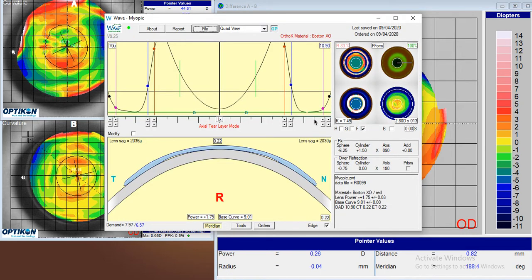Back to the lens, how that translates to the lens view, especially in that area where we were seeing some flattening, suggests that the lens on the outer half of the alignment zone is pressing down on the cornea a little bit more than the inner half of the alignment zone. And generally we want that to be fairly uniform. So we'll make an adjustment, and overall we'll want slightly more touch across the alignment zone altogether.